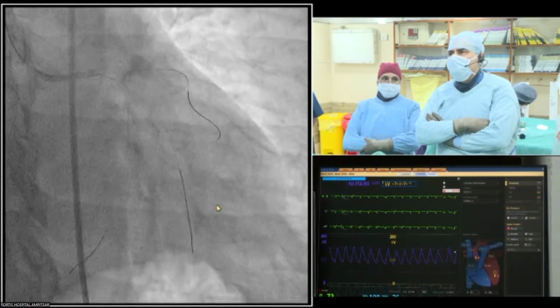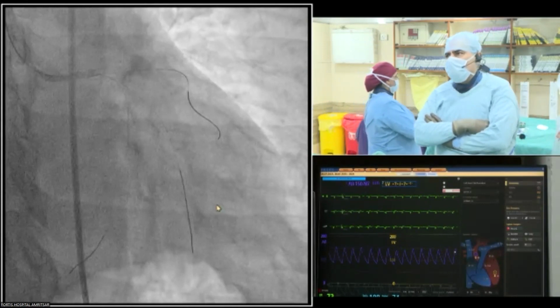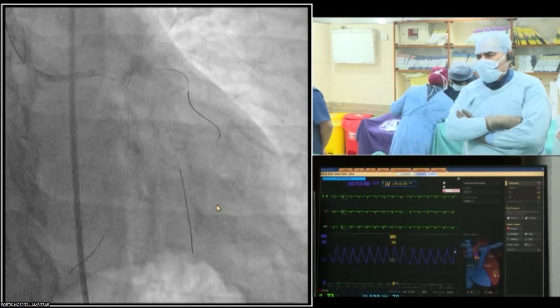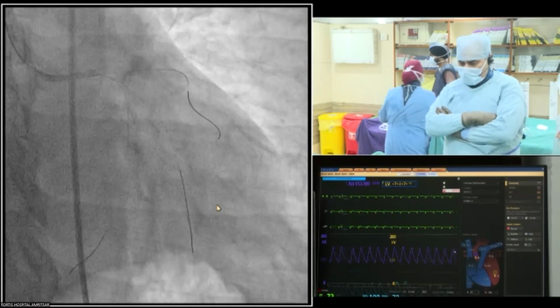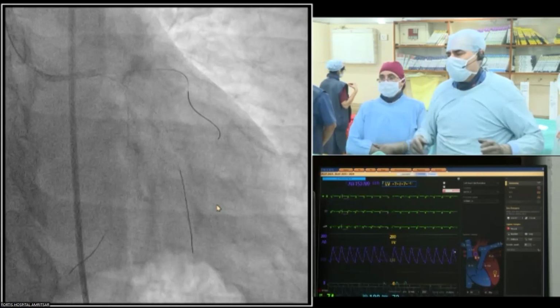It's definitely not. That's why, number one, I think prevention is always better than cure or trying to struggle. We could have just either tried prolonged balloon inflation. You yourself said that I will be opening that stent strut. That's what I might coincide. You cut the stent 1.4 millimeters back, instead of extending more into the LMCA, and then it would be a lot simpler. Yeah, the LMCA strut.